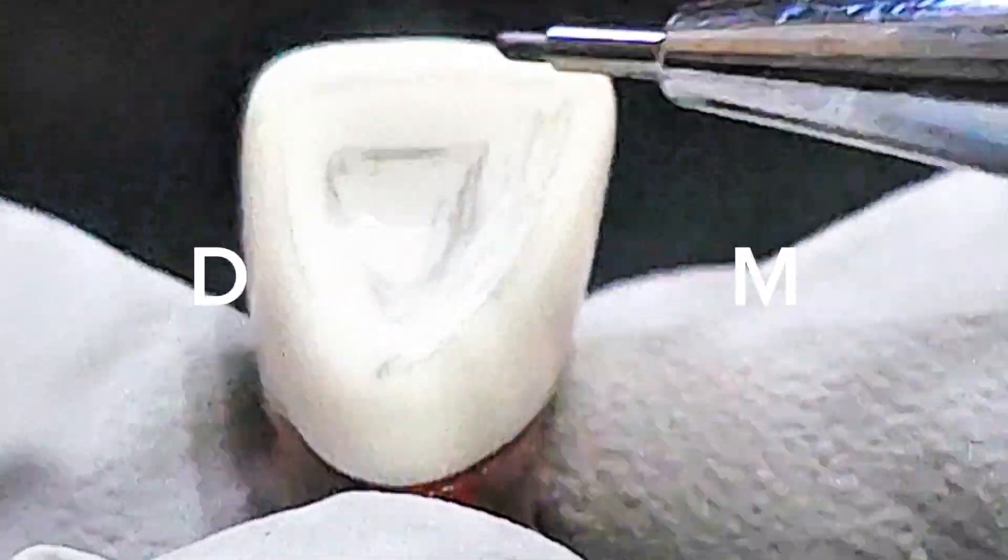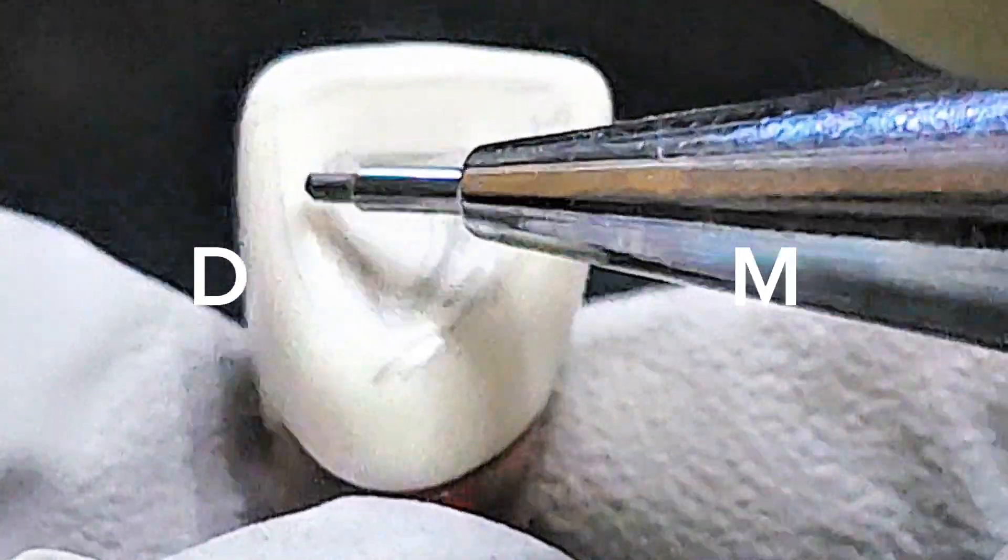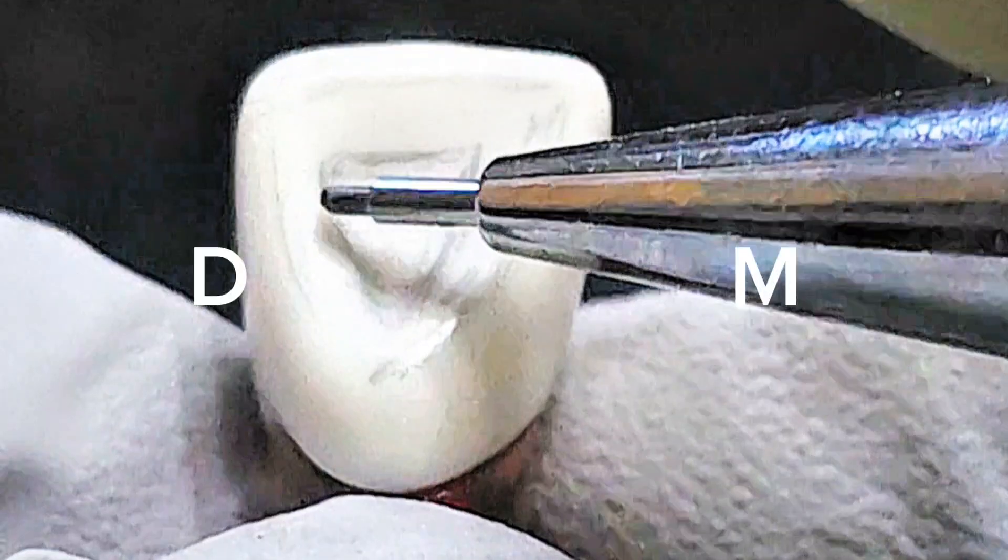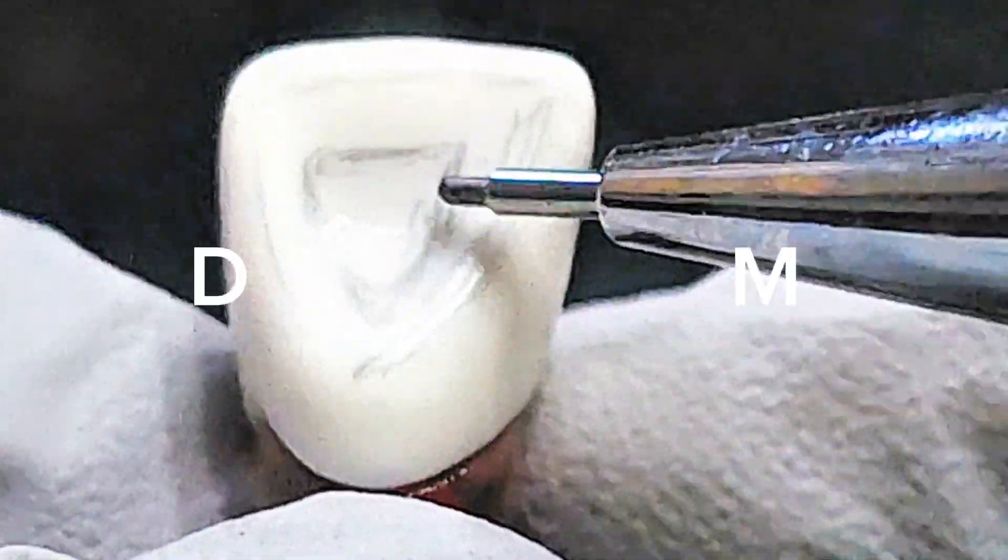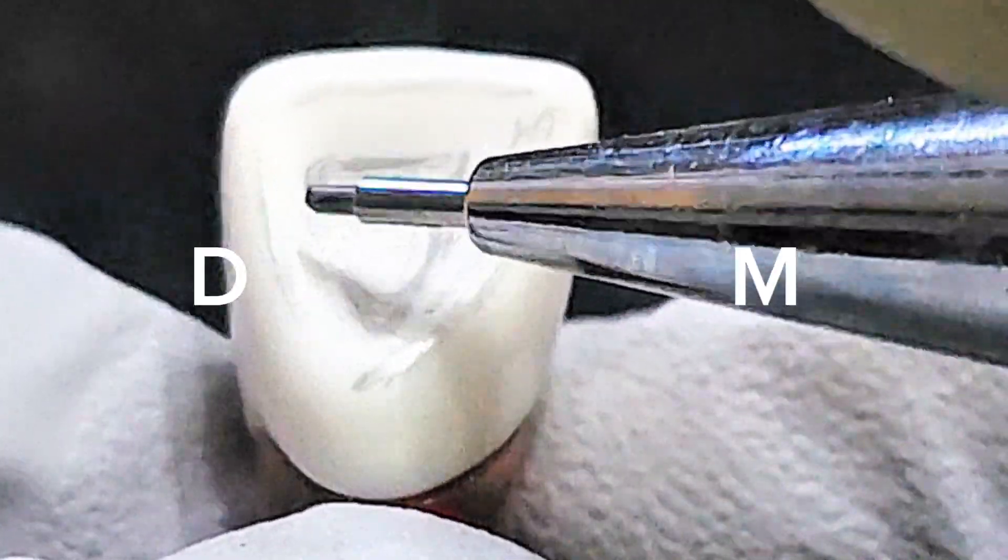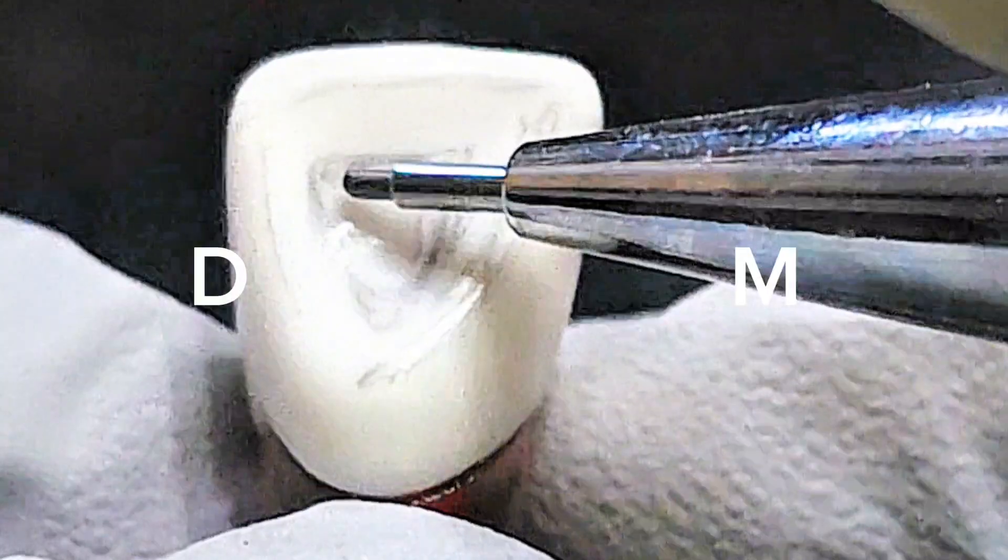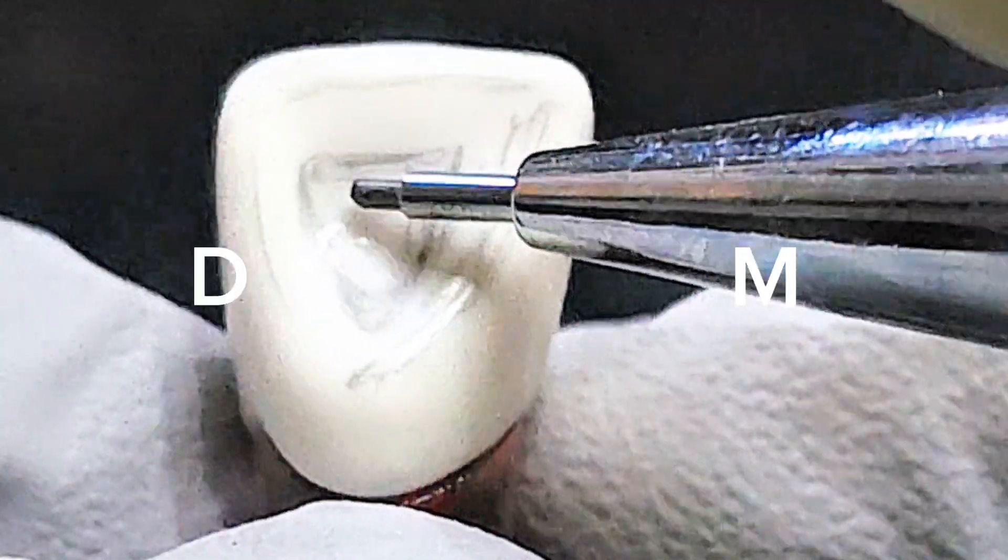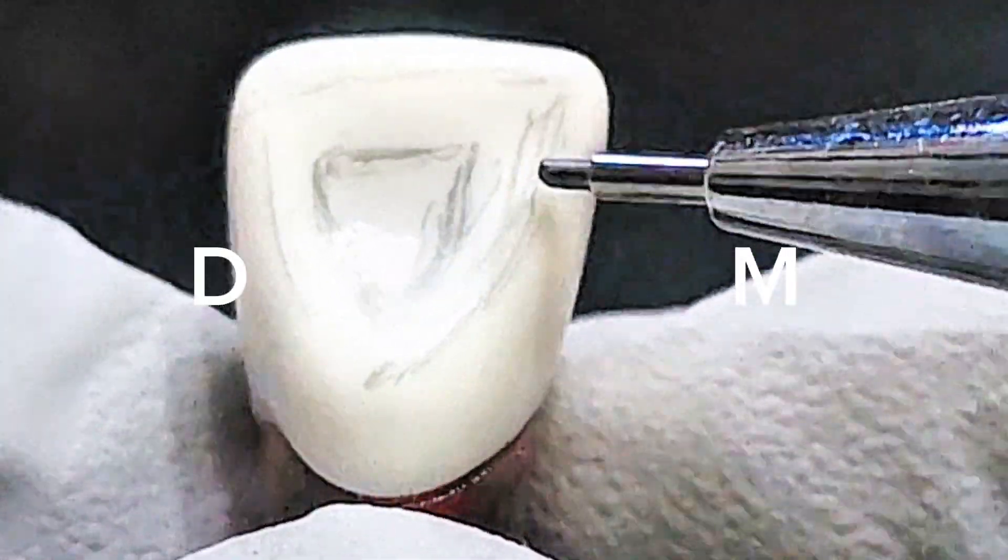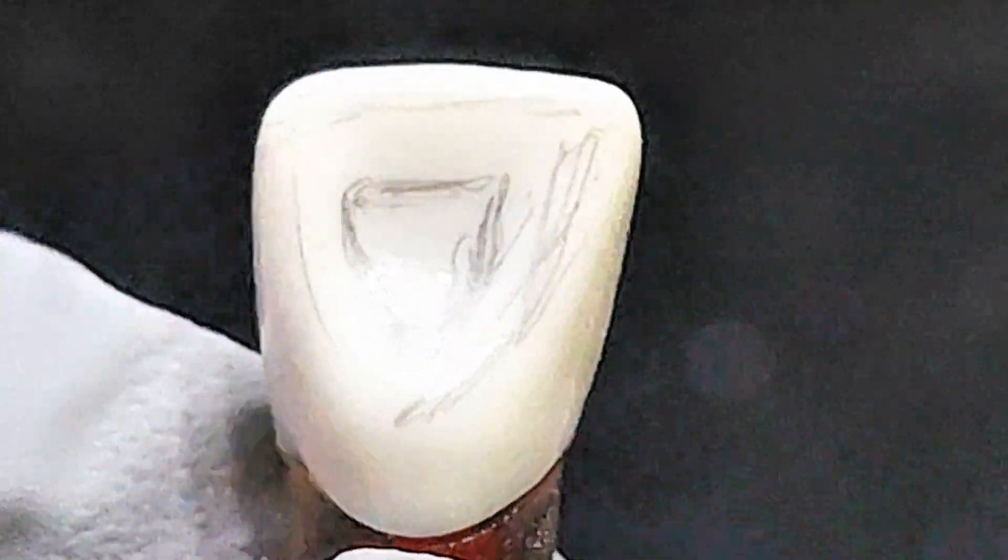This is the outline, but you can make it like 1.2mm, 1.5mm. But don't make it bigger than or really tight to the 1mm because there is a chance to fail. So let's try to cut the tooth and see how it is inside.